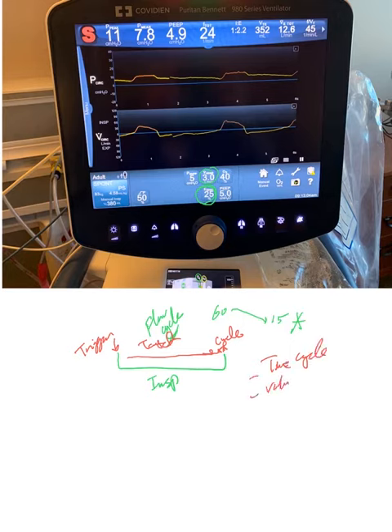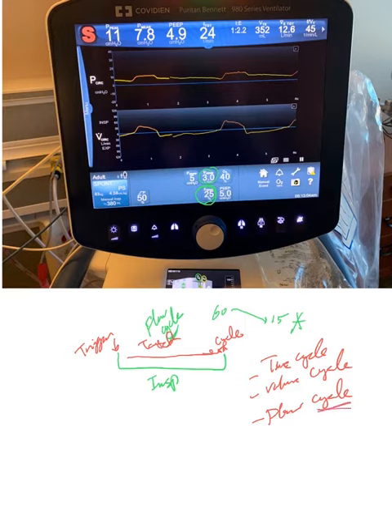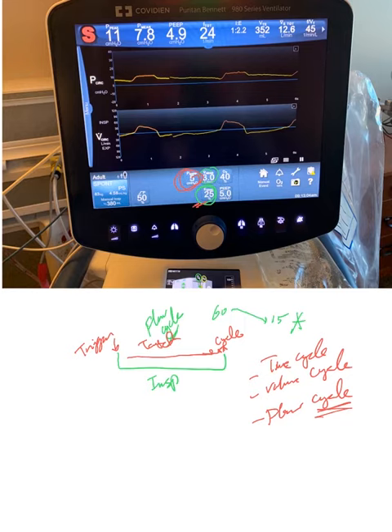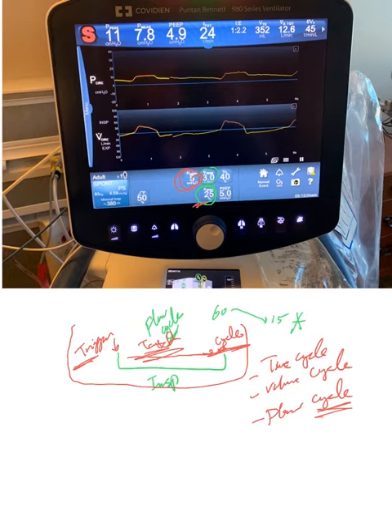We have volume cycle, flow cycle, and pressure cycle. So basically, cycle means when to terminate the breath — and this is the cycle right here. We'll demonstrate the cycles every time. Now we put up a picture of a ventilator and demonstrate the target and other things here, including the pressure target. So now we've finished trigger, target, and cycle — the ventilator has all the information to work for us.